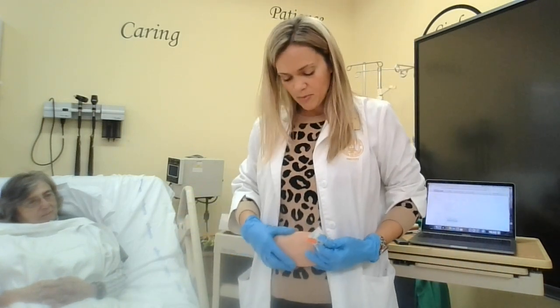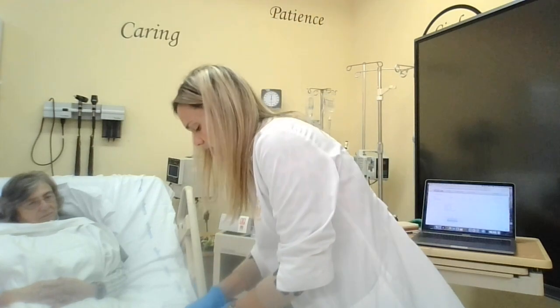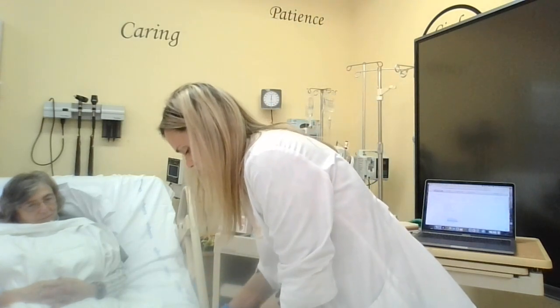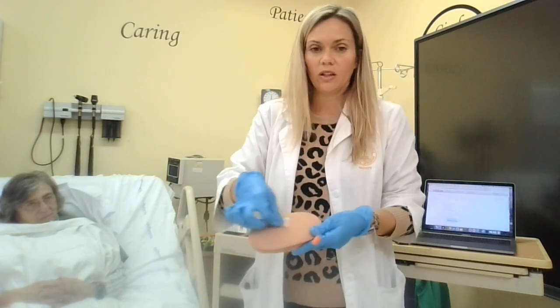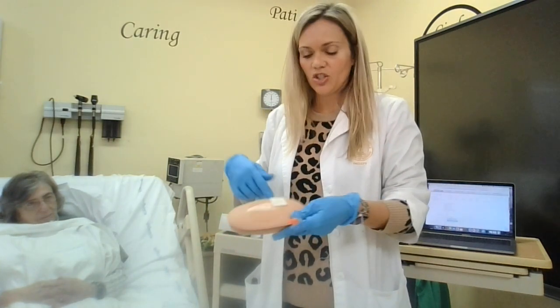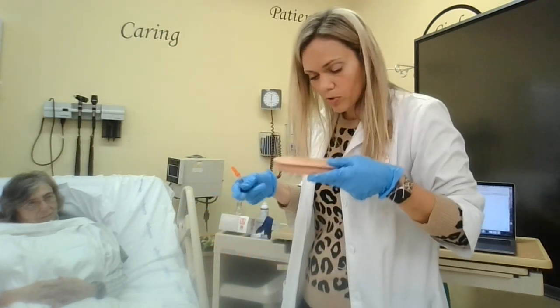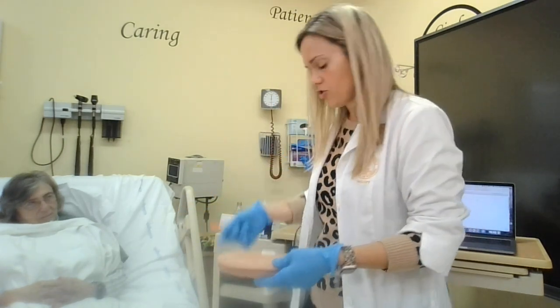If you're using the abdominal area, make sure you stay at least 2 inches away from the umbilicus, the belly button. So at least 2 inches on either side. So I'm going to go ahead and clean the area. I like to point the alcohol swab towards the area that I just cleaned as a reminder of where I cleaned. Make sure it dries. Don't blow on it. Just let it air dry.